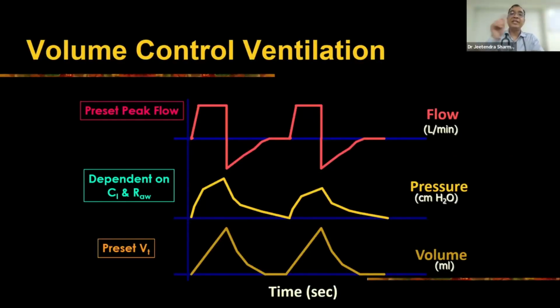Whereas in the pressure control, time trigger, pressure limit, time cycle. Volume control, time trigger, flow limit, and volume cycle. That's very important.